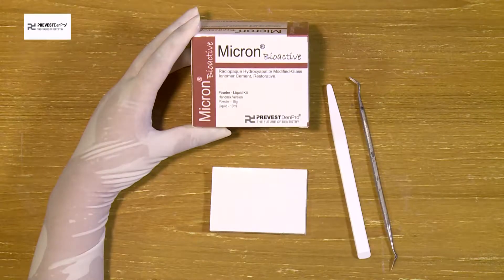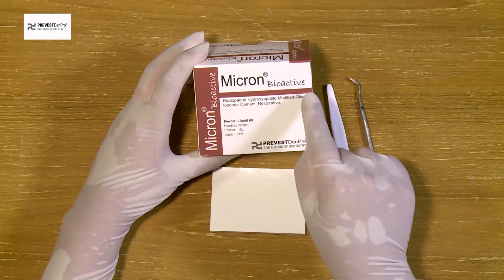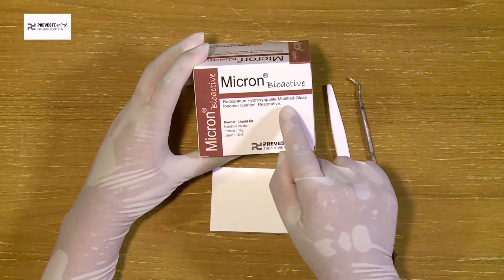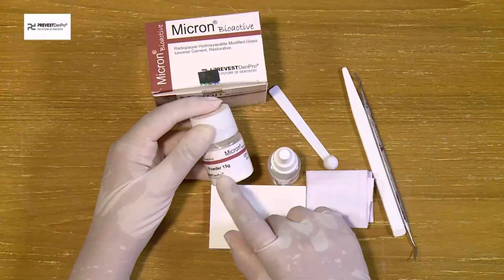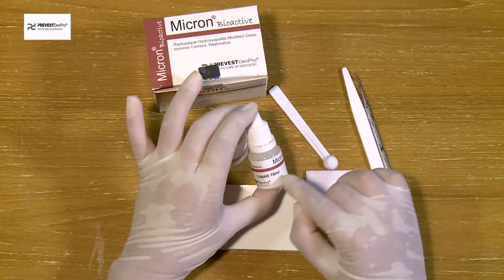We are happy to introduce Micron Bioactive, manufactured by Prevest Denpro Limited, which is a hydroxyapatite-modified glass ionomer cement. The composition is highly biocompatible and bioactive. The kit contains 15 grams of powder, 10 ml liquid, a dispensing spoon, a mixing pad, and an instructional manual.